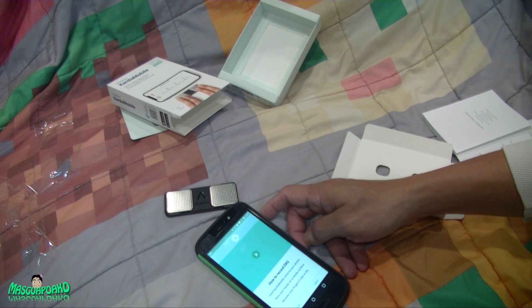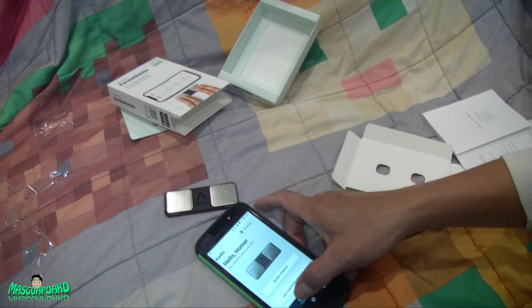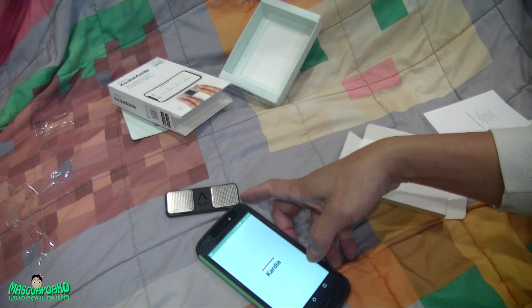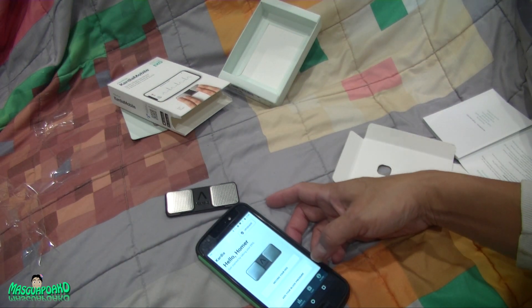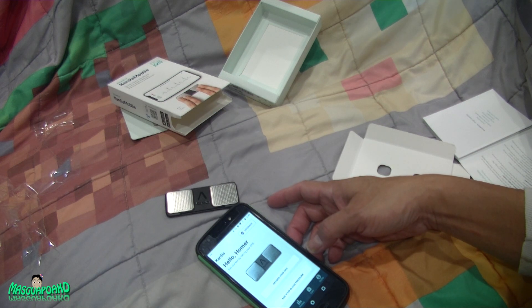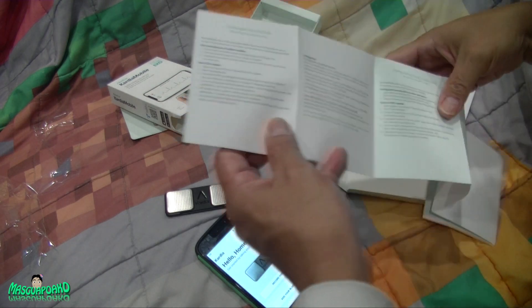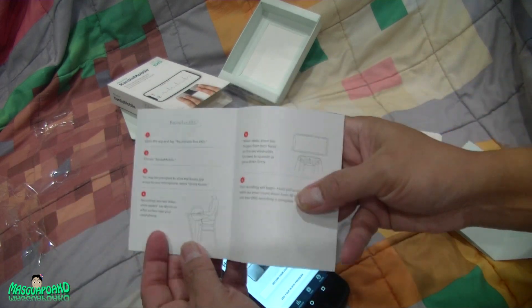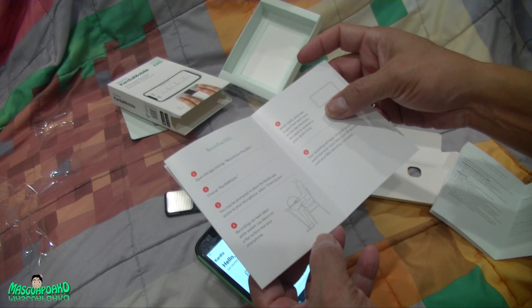To record, hold the device close to your phone, press with your hands — make sure there's moisture in your fingers. Hold it very close. I have to sit in a chair like this to get a proper reading, so I'm going to do that and see if it works.